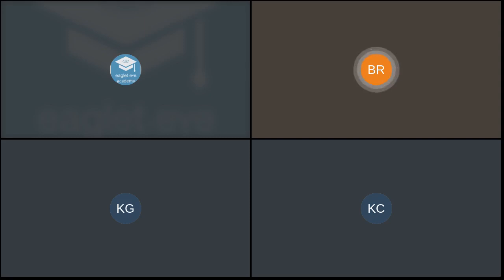If you want to spend less time, and time is money, then the Eaglet, or you need just some data to know the sclera. And the last thing I'll say to that is patients who have worn sclerals before know the process. You're going to come in, we're going to fit you, we're going to order a lens. Two weeks later, you're going to come back, we're going to fit you.